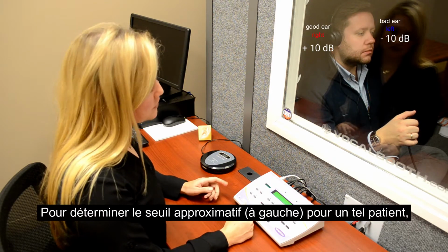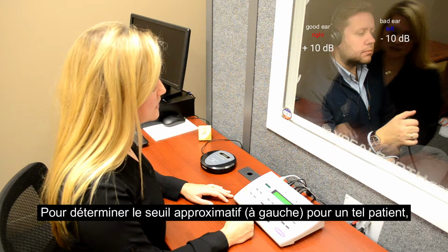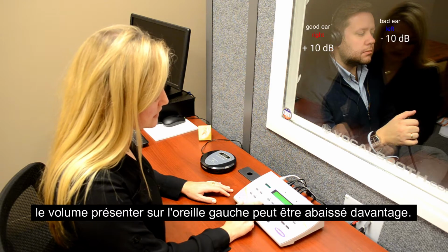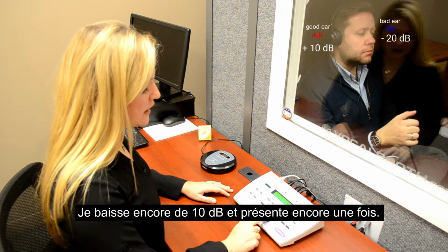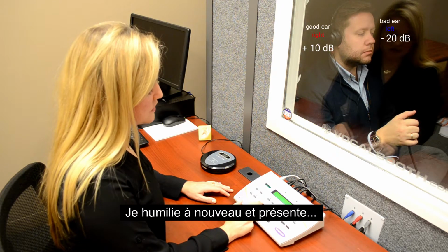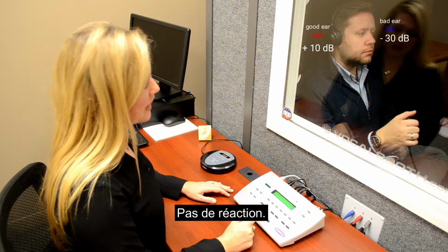And if you have a patient like this, if you want to try to figure out what their possible threshold is or something close to their threshold in that left ear, you can continue to decrease it. So I'm going to decrease it by 10 again and present it, and he still didn't press the button. And so I'll try again and decrease it by 10 and press it, and he's still not responding.